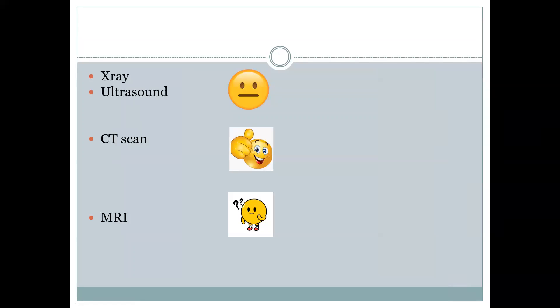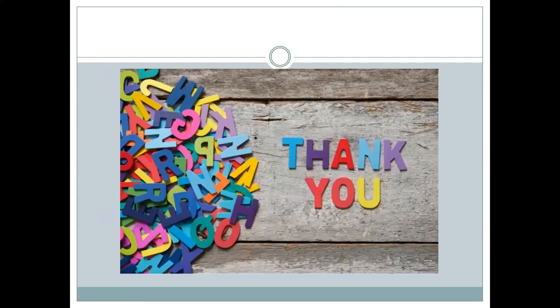In conclusion, abdominal X-ray and ultrasound, though widely used in emergency settings, have quite low sensitivity for gallstone ileus due to many factors. The modality of choice is CT, which helps identify gallstone ileus and alternative causes of the patient's presentation. MRI is used only when the fistulous communication needs to be clearly delineated. Thank you for listening to this presentation.